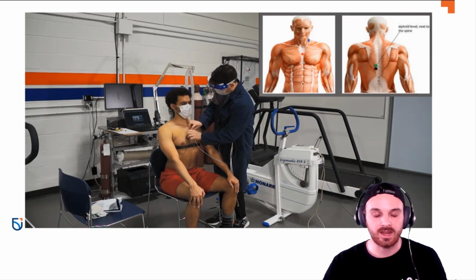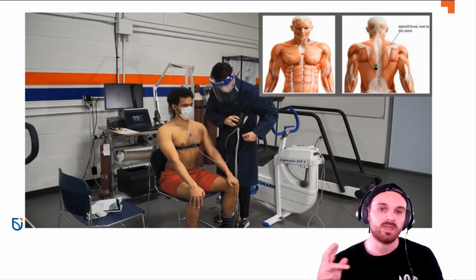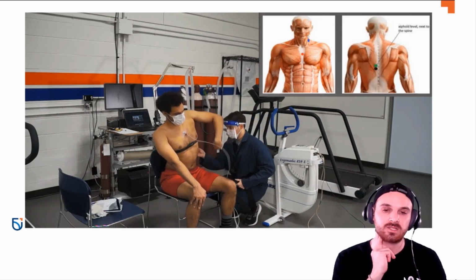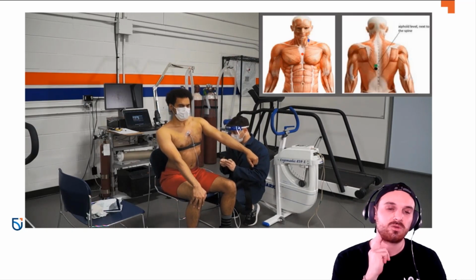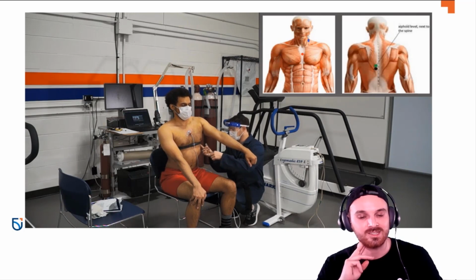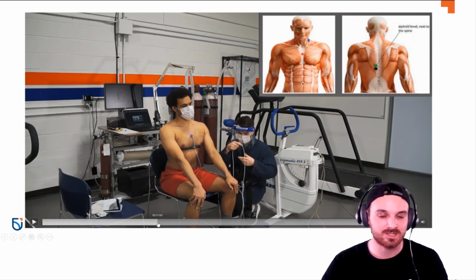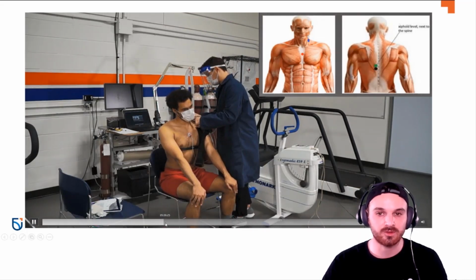The one thing that I typically forget, and isn't super comfortable for the participant, is, again, those side electrodes. One of them is over their SCM, their sternocleidomastoid, but one of them is over a sort of semi-soft tissue up under the neck by the carotid. Pressing that onto the participant isn't always the most comfortable, but once you've already had the area prepped, it's very hard to go back. So this is something that you can see isn't always super comfortable for the participant.